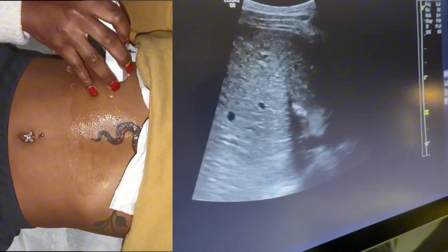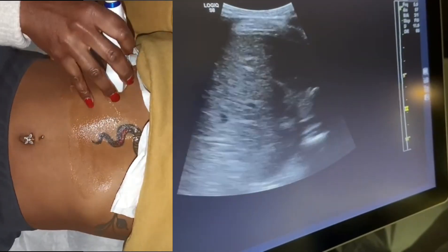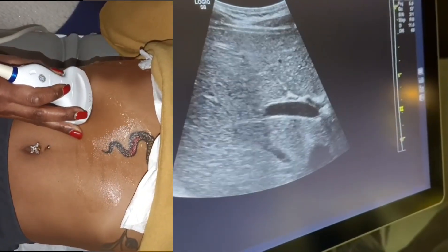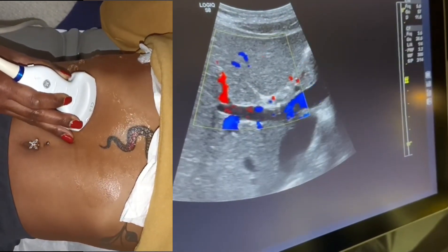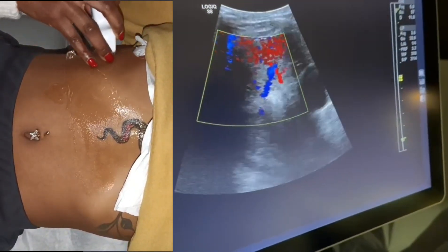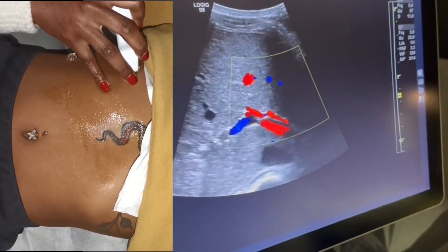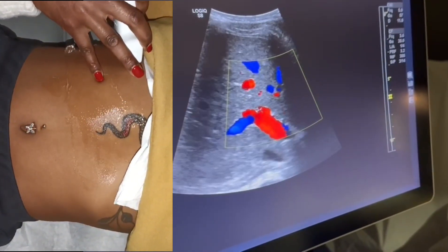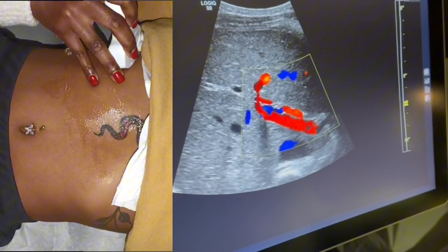Going right in between the ribs, I can see my portal vein coming right into the liver. I'm getting a good window — there's the portal vein. I'm going to put color on it. That is your portal vein right in the liver. I want that nice parallel window, sliding in between those ribs. Main portal vein is right about there, and I'm going to Doppler the portal vein.